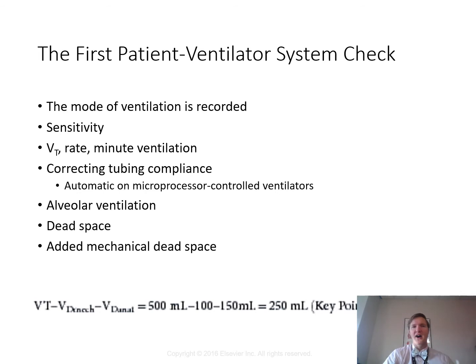Or it could be pressure controlled continuous mandatory ventilation, where every breath is going to be the same size breath, but instead of using volume to dose it, we're using pressure to dose it. We're using pressure to deliver that breath. We could be using things like intermittent mandatory ventilation. You might see that more commonly in your neonates. And that one you could use either pressure control or volume control with it. And even in that one, you can use it with or without pressure support.